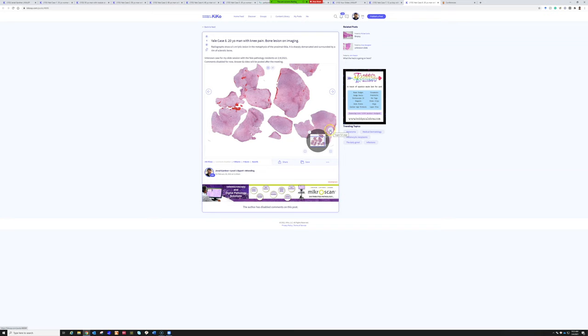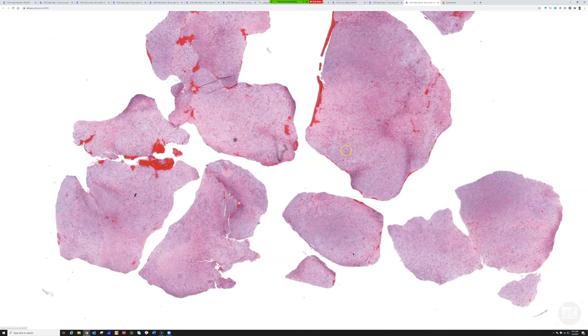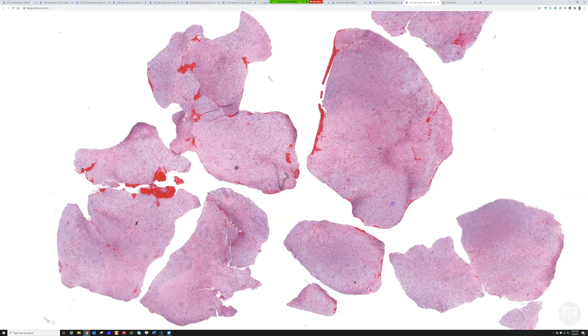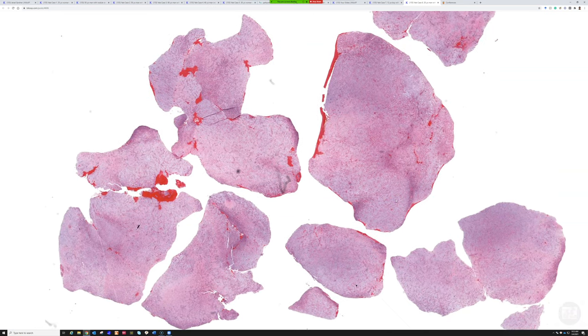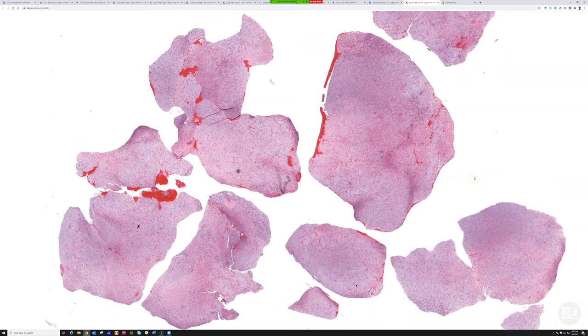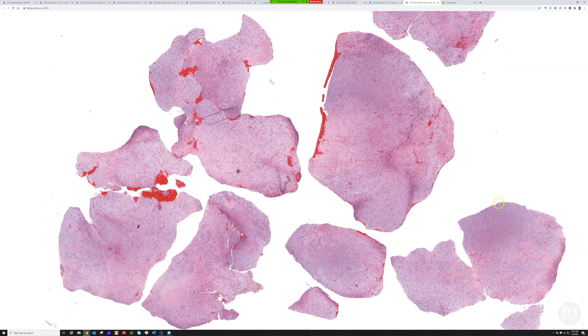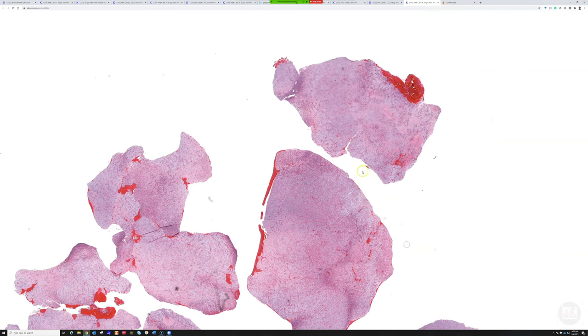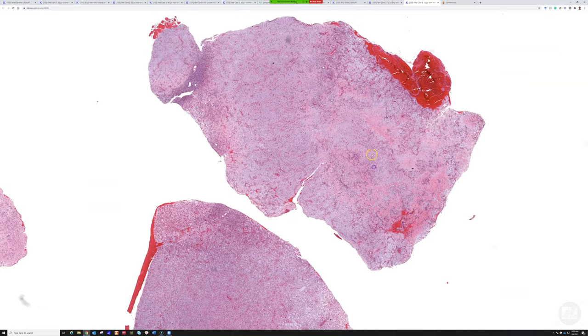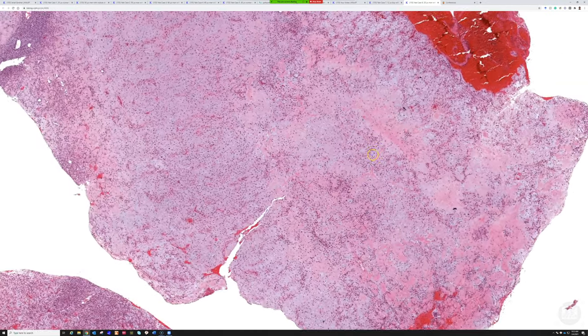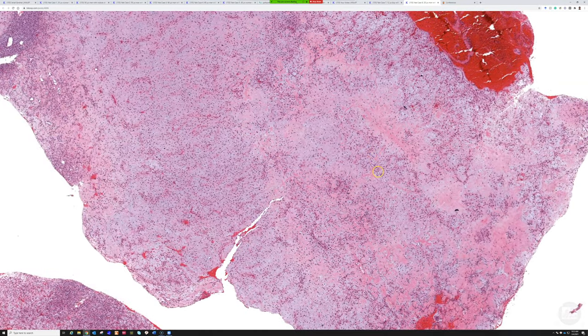Who wants to take this one? Good morning. On low power we can see fragments of bone lesions that are alternatively pink eosinophilic and light blue to pale areas.